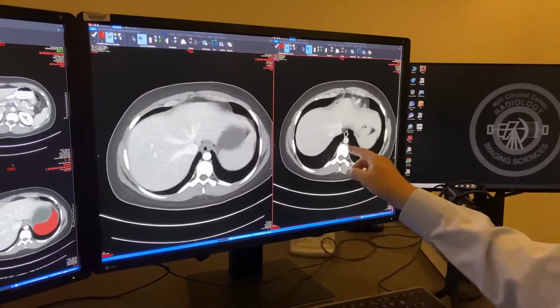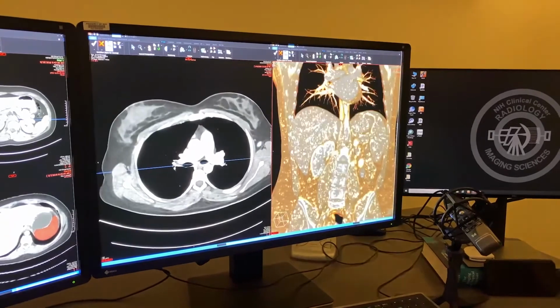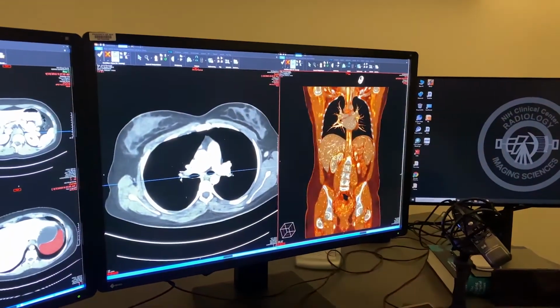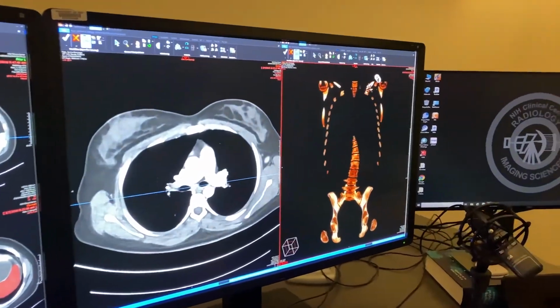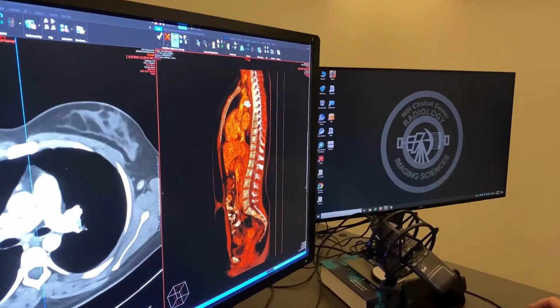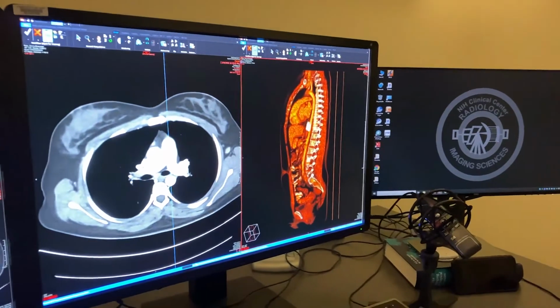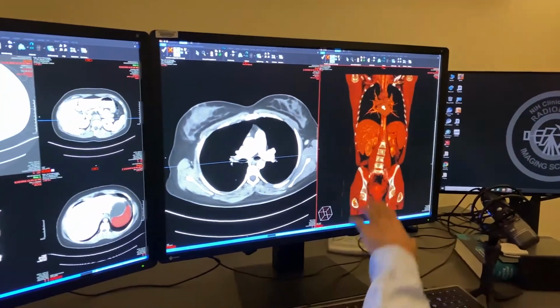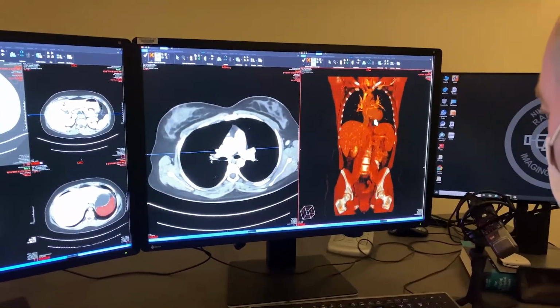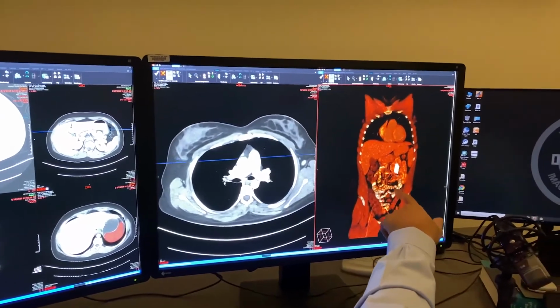So then we look at the vasculature here in the center. This is aorta as it came down. So here, let me just put that in a big view here to see the vessels. I'll just change this window and level a little bit. So what we're looking at now, kind of drill down into the vessels, is that aorta. I can put it into a sagittal view. So here's how the aorta came out of the heart and it's coming down. So we're just going through and looking at that tube as we go down into the iliacs. And then here's the aorta dividing into right and left iliac arteries, and we're looking at all this.